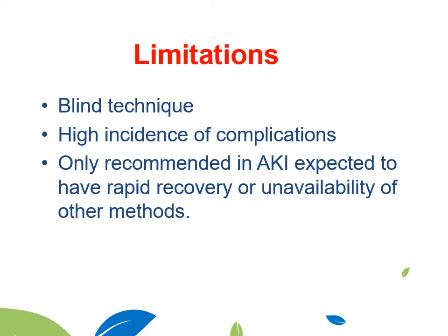We have some limitations for sure. Since it's a blind technique, a lot of complications may happen, so it should be restricted only to acute kidney injury where there is some expectation that it will recover very soon, and just in case no other methods are available, as we mentioned earlier, to manage such patients.